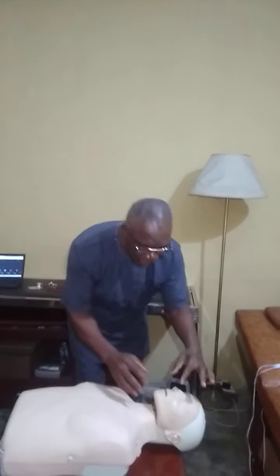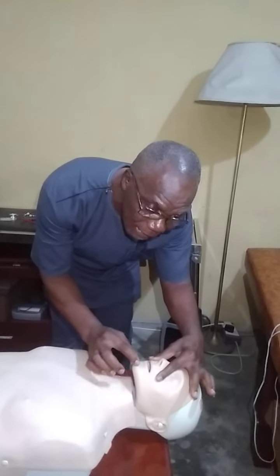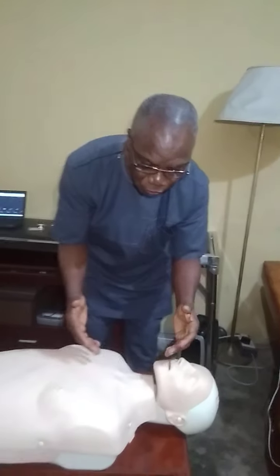Now, as you have given that instruction, the next thing you do is to check the airway, whether the tongue had fallen back to block the airway. Once you are satisfied that is not a problem, the next thing that you do is you start CPR immediately. We want to keep this person alive.